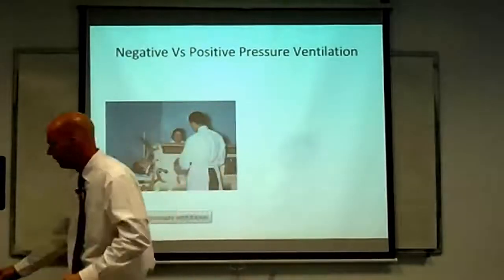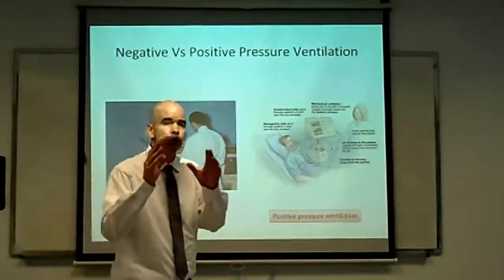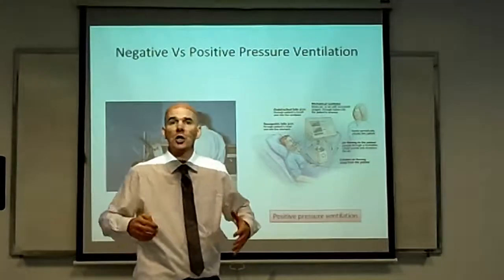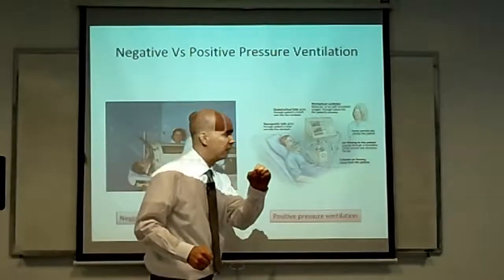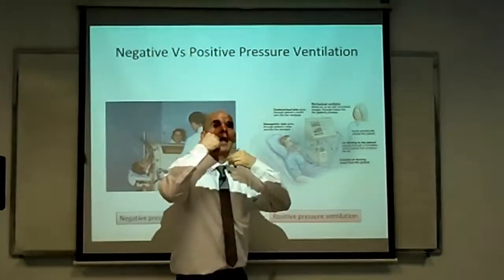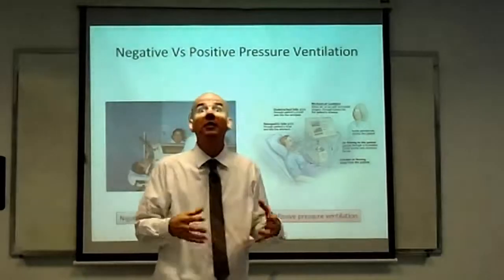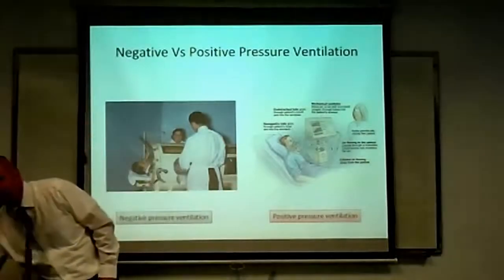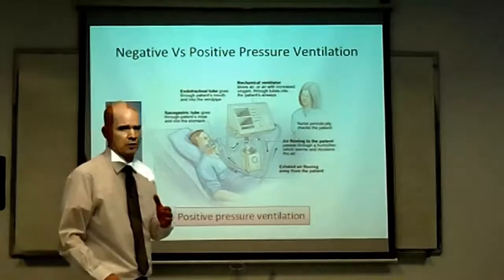That's why positive pressure ventilation was developed. Positive pressure ventilation works on the exact reverse principle of negative pressure ventilation. Instead of using a negative pressure to open up a patient's lungs from the outside, positive pressure ventilation takes high pressure air, superatmospheric pressure air, and forces it into the airways from the inside, essentially blowing the lungs open from the inside out. Now these machines, these positive pressure ventilators, are much more practical, much more convenient, much easier to use than the negative pressure ventilators.